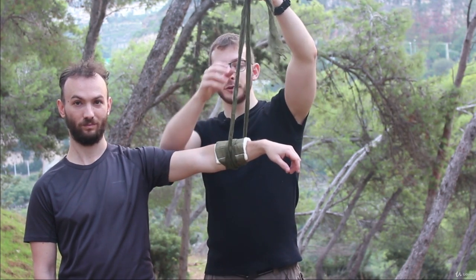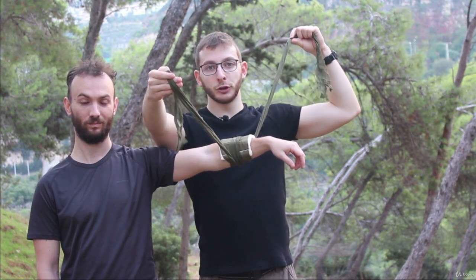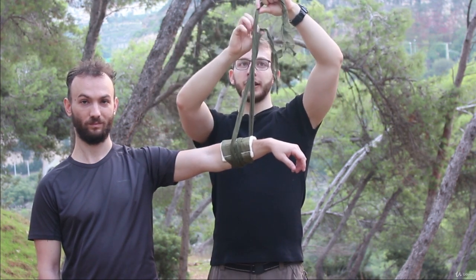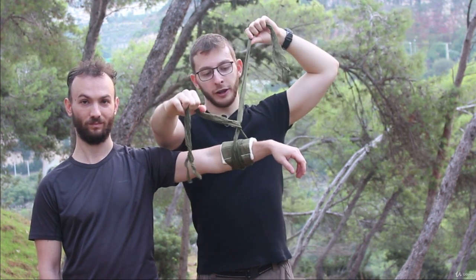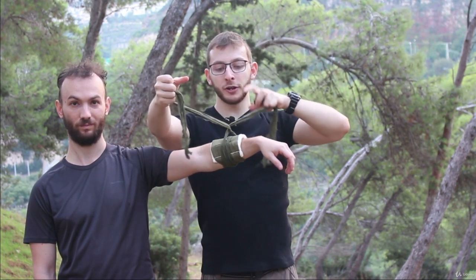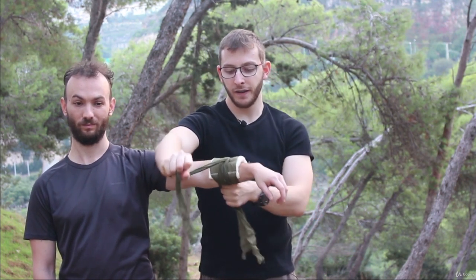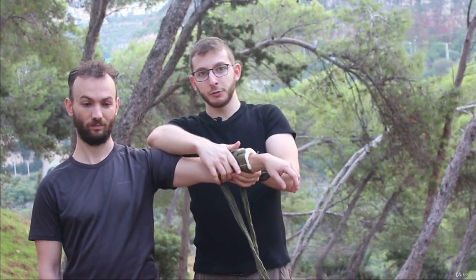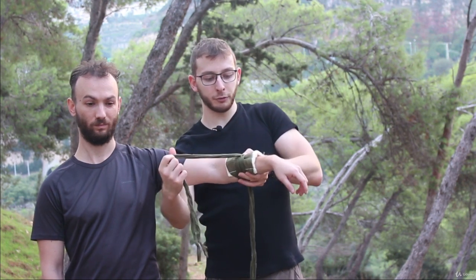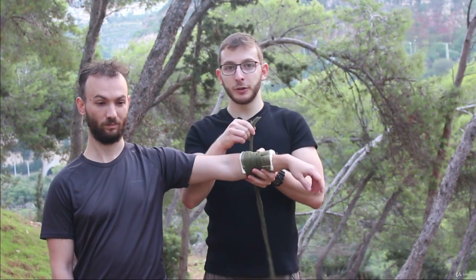So the first thing I want to do is, I have one string in the front and one string in the back, and I want them to switch places. So I will take the string that is in the front and make sure that it returns to the front. And what you see is I now have this twist in the middle. Now I want to pull on the sides so it will put as much pressure as I can. Now I'm going to hold this with my thumb so it will not release, and I will take the string that we have in the front and wrap it around over one of the sides until I have a little bit of string on top.